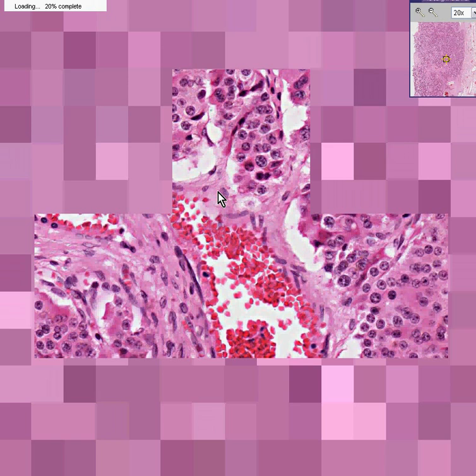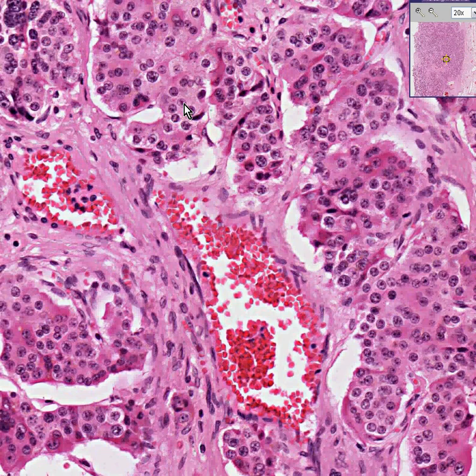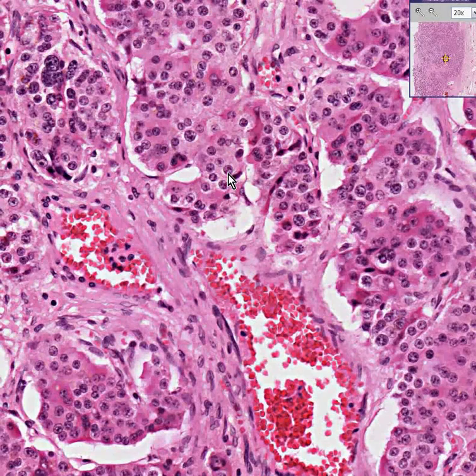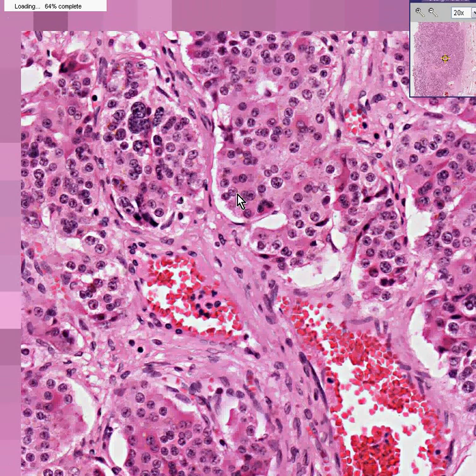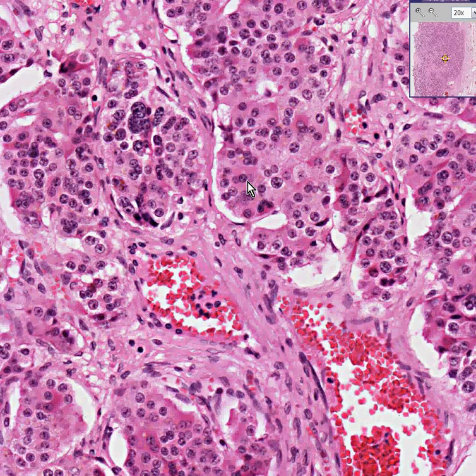They may share some semblance to the Sertoli cells that you see inside of tubules, which have abundant red cytoplasm. But there's absolutely nothing on here at all that looks like a germ cell. In fact, they don't even really look like seminiferous tubules — they look more like clusters of these little cells that resemble Sertoli cell tumors. This is a Sertoli cell tumor.